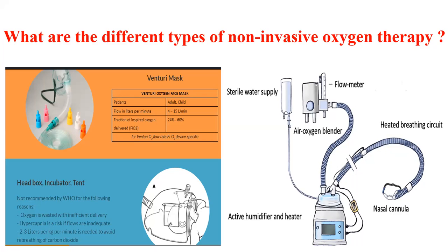Excuse me, my computer didn't show my screen. Dr. Apollinaire, the screen we have on is the different types of non-invasive oxygen therapy.